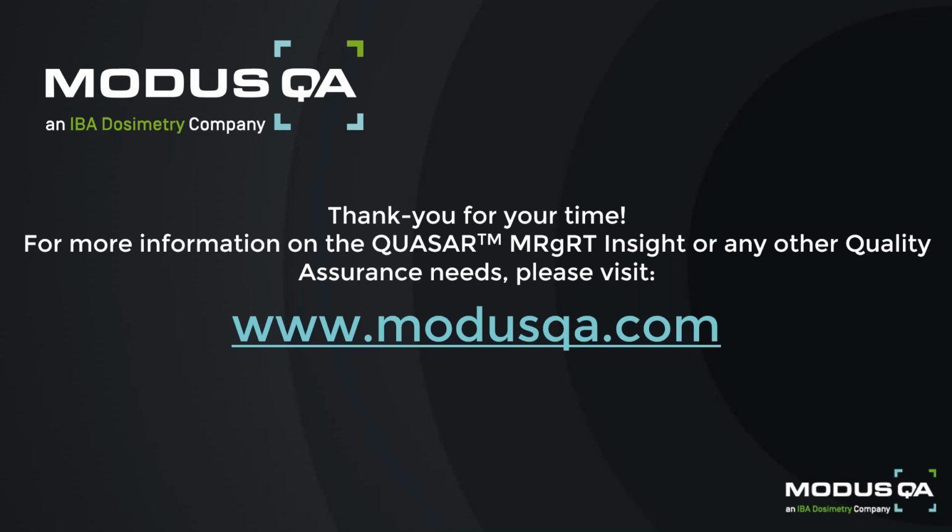Yes, great, thank you. Our next question: is it possible to use only the upright section of the Phantom, without the base plate, for axial scanning? This participant would like their technicians to perform a quick daily scan and does not need the bottom portion. Okay. Once again, thank you for the question. You can definitely use just the upright or just the coronal base plate for a quick and easy setup and a daily scan.